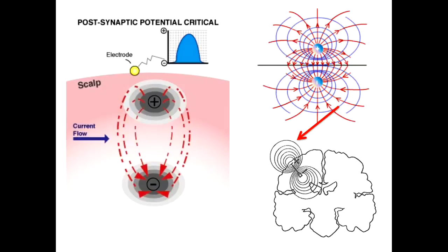And this is even used intraoperatively if you're working on someone's spinal cord. Let's say you're putting in a rod for scoliosis or something. You want to make sure you're not over-twisting the cord. So very useful. This is a near field, the electric field that is generated by the current flow, which has been induced by the postsynaptic potential hitting your dendritic tree. This electric field is picked up as a potential, a change in electrical potential over time, on the surface of your brain with an electrode right here, pre-surgical, stimulating your right hand. I put little shocks on your wrist, and I record here, and that's how we get this potential on the surface of the brain.